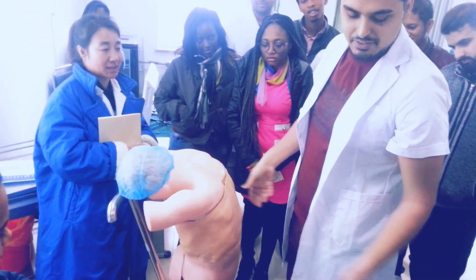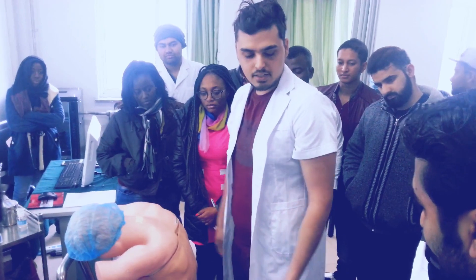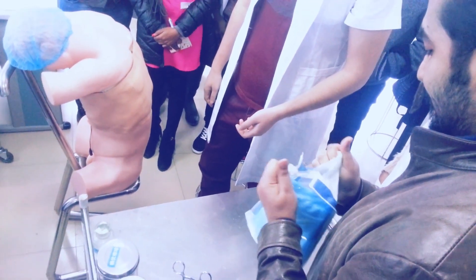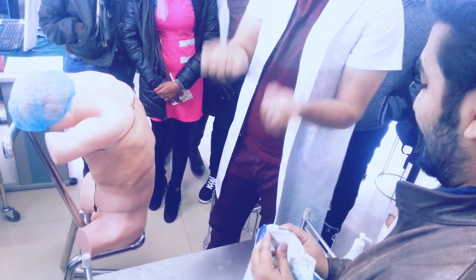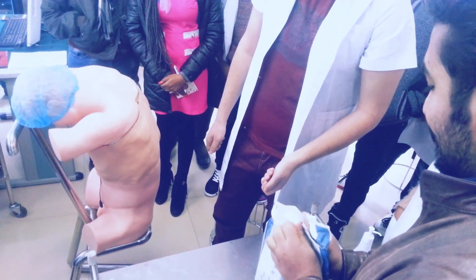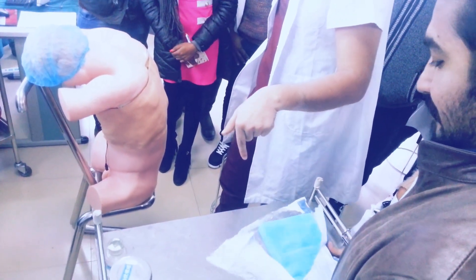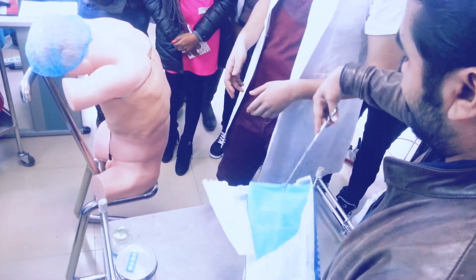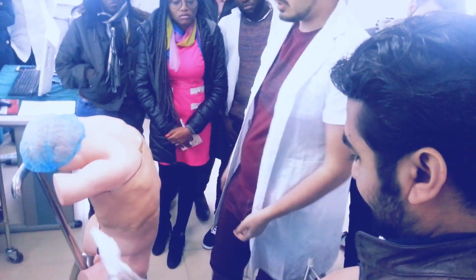Then after that, I will disinfect my hands again, like I showed you earlier. Then my assistant will open this. First I will check the date. The assistant will not touch the inner cloth or the inner area because it's a disinfected area. If you touch that part, then your marks will be compromised and you will need to get a new kit.